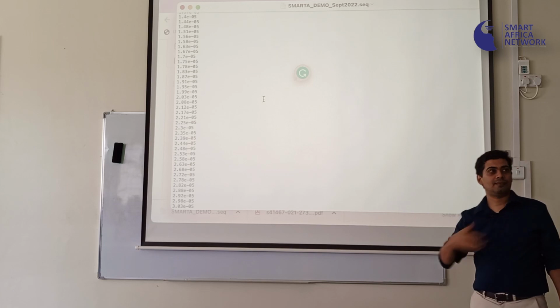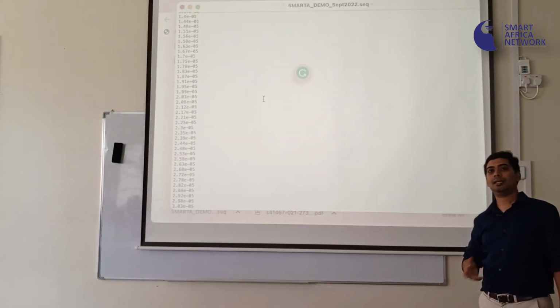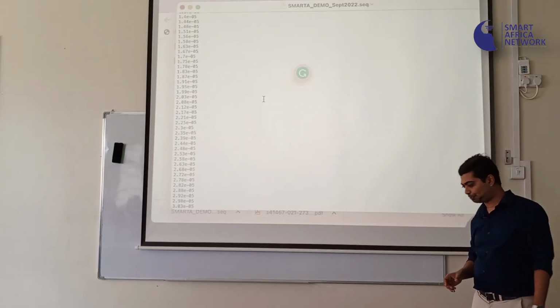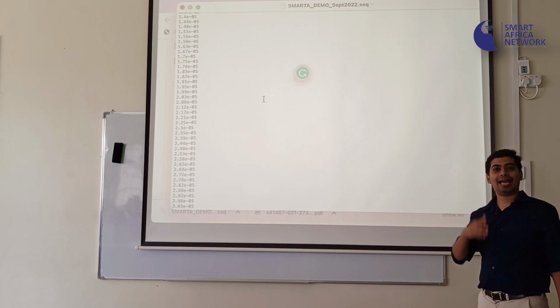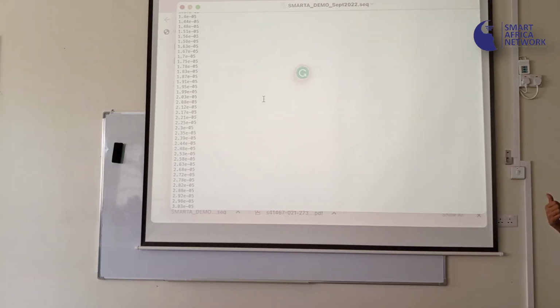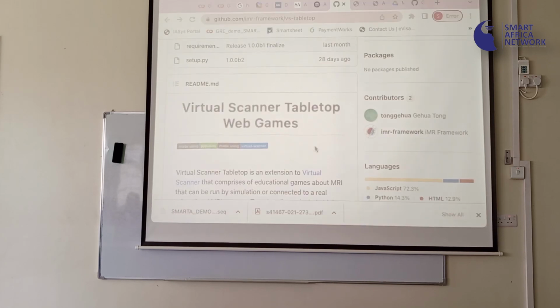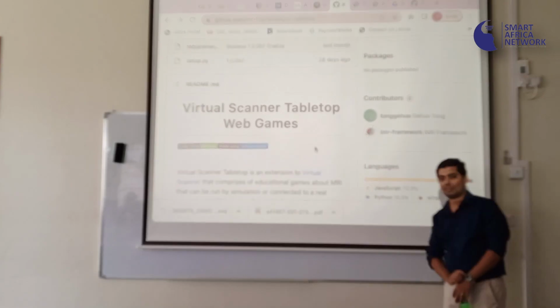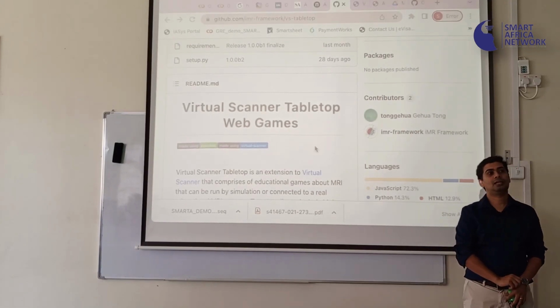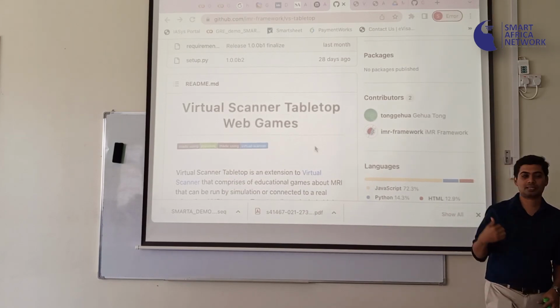This file is giving instructions particularly to the hardware and saying, this is what I want you to play. At this time, this is the kind of shape I want you to play, and then there is a bunch of hardware in there that will actually take these instructions from the computer and play them on the real coil. So that's where we got. You could take this with the right tools and play it on a Siemens or a GE or a Bruker or any system with the MaRCoS spectrometer, even the OCRA, the KR2 spectrometer, so you should be able to play all of these sequences.